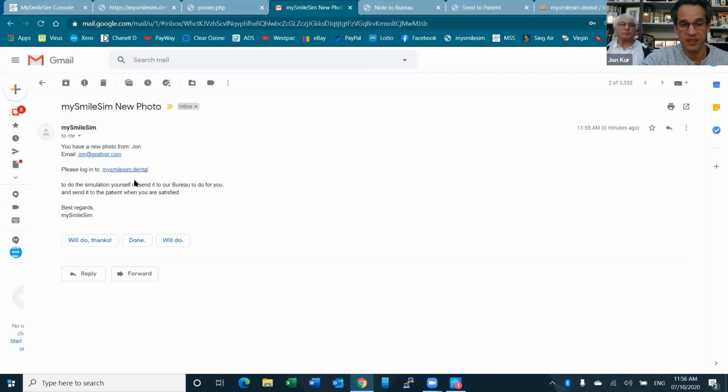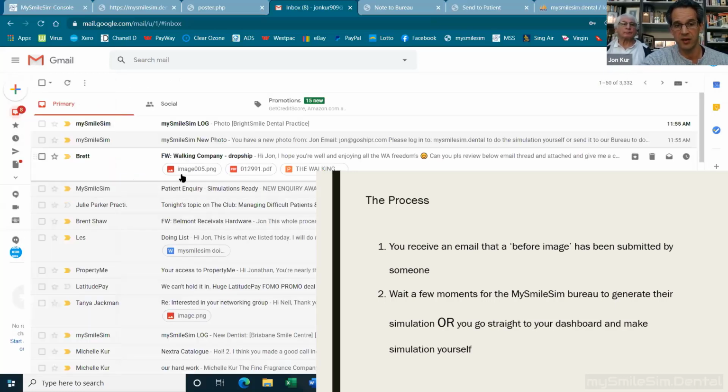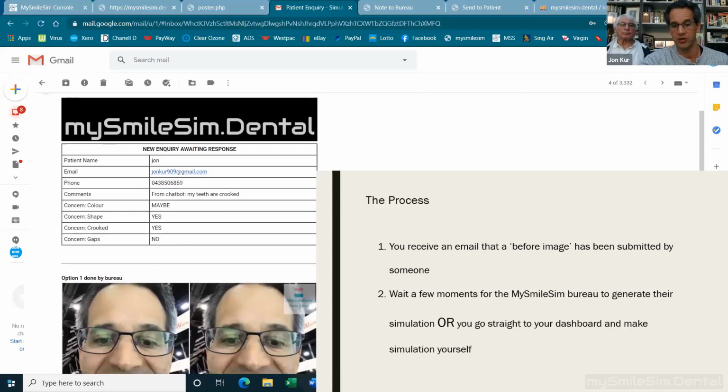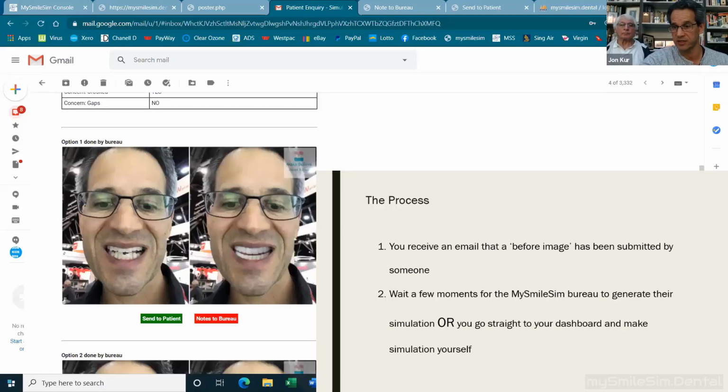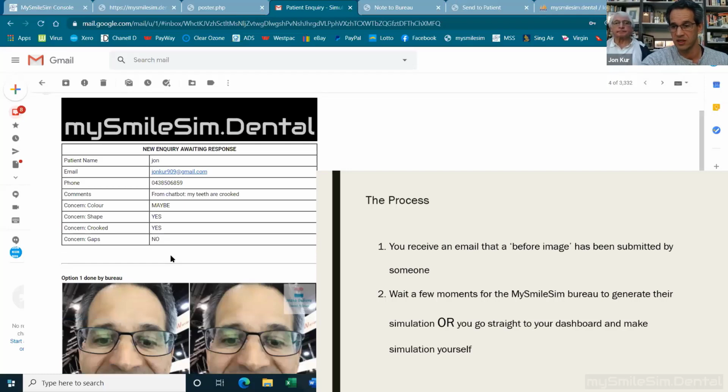If you're the type of practice that wants to do the simulations yourself, you would log into your MySmileSim dental portal and you'd see the new photo there, and off you go. You can start playing with it. If not, you could wait for the second email. The second email will come just like we had before, showing the ones the bureau has done, and you don't even have to log in. You can just send that off to the patient with your note. And that's the simplest way to use it.